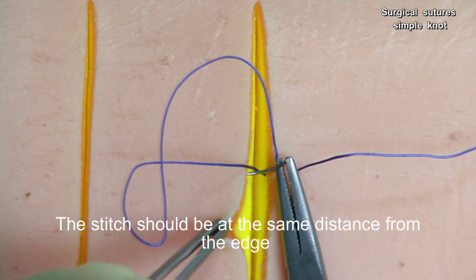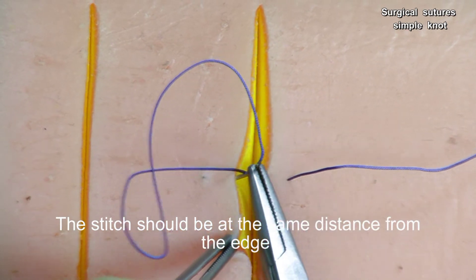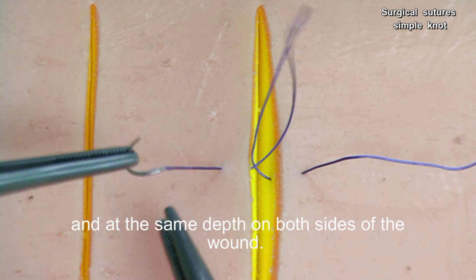The stitch should be at the same distance from the edge and at the same depth on both sides of the wound.